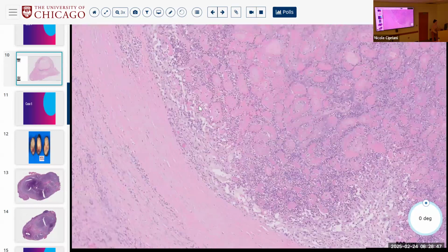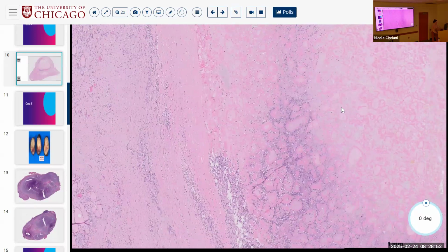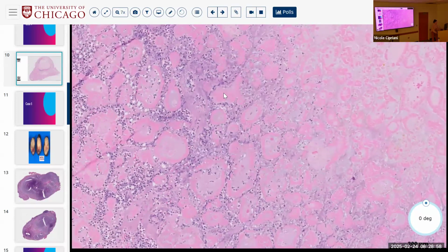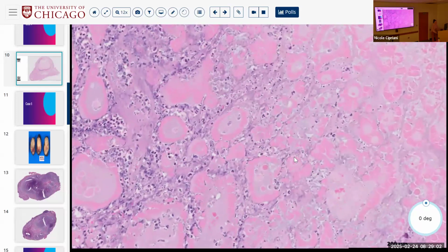But with this amount of necrosis, even though it's sort of encapsulated, I'm thinking this is something malignant, especially with the amount of necrosis. And with these, they kind of look amyloidy. So I was kind of thinking, is this medullary? I don't think I've ever actually seen one.